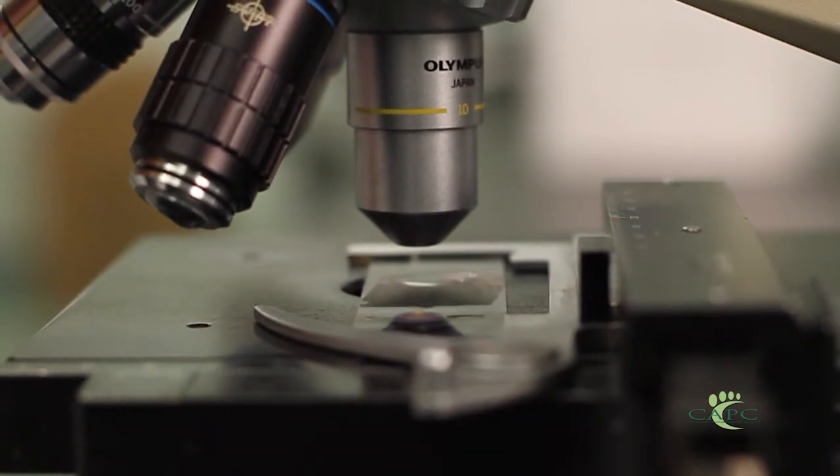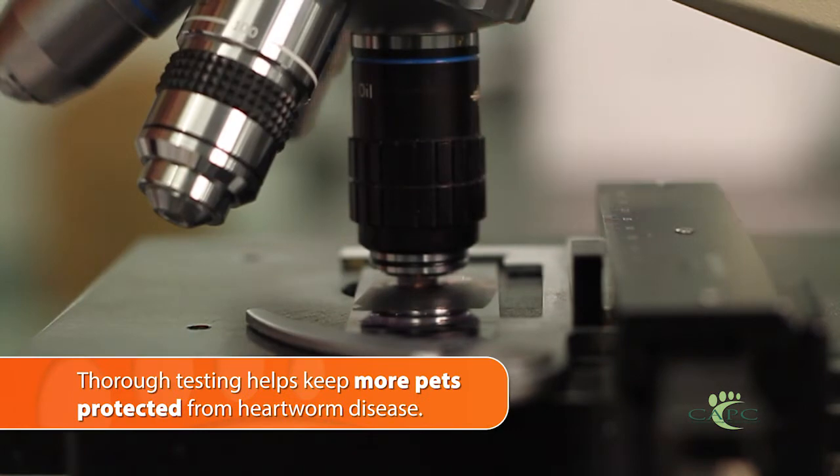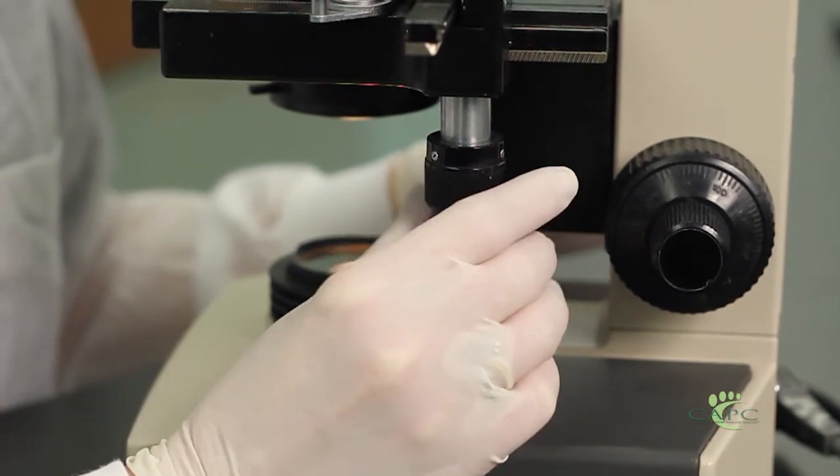While not as sensitive as the full knot test or filter test, examining a drop of blood will tell you if there's a high number of microfilaria present, and that might let you know there's a heartworm infection where the antigen is not available for detection.